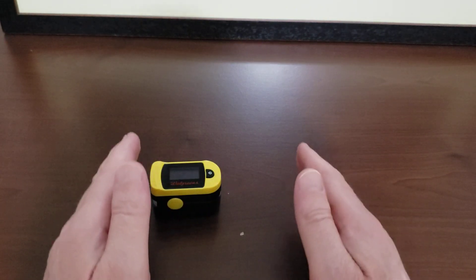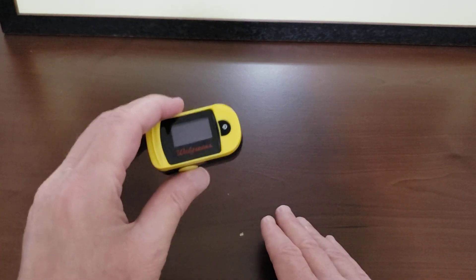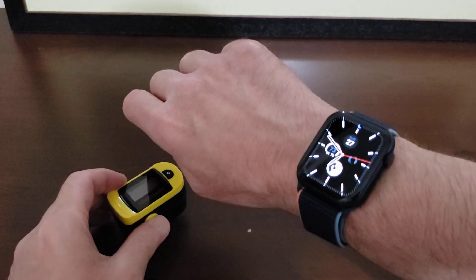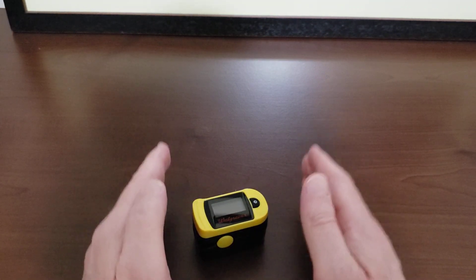This video is for entertainment purposes only and is not meant to be medical advice. Regardless of how good you think you feel or how good this watch or any device is telling you that you are, seek professional medical care.